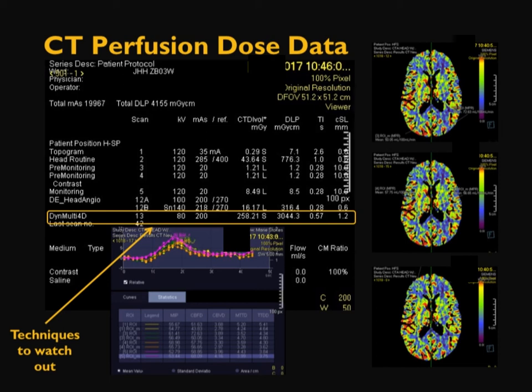The word of caution is, if the skin dose exceeds 3000 mGy, there is a chance of initiation of early erythema or hair epilation. So that's one thing we need to watch out for while performing CT perfusion, to make sure the protocol is well optimized. From these dynamic studies, as shown in these images, the system automatically generates various quantitative parameters such as the blood volume in the region, mean transit time, peak flow, and so forth, useful for evaluation of the stroke patient.